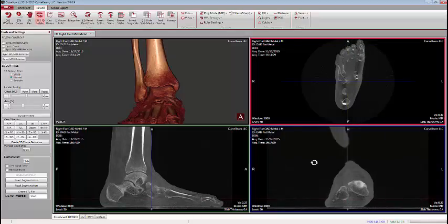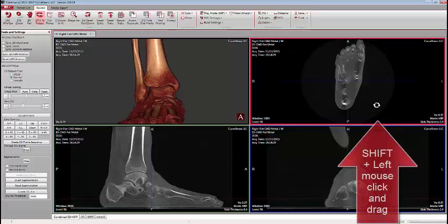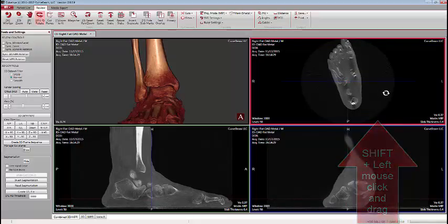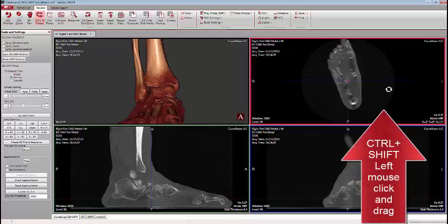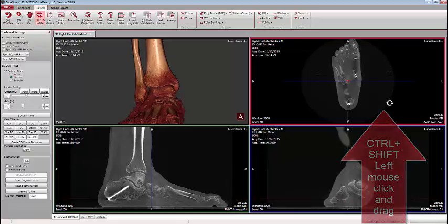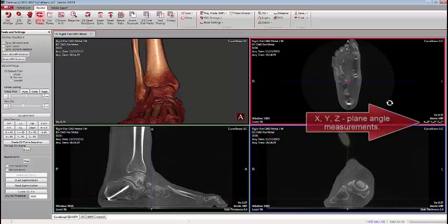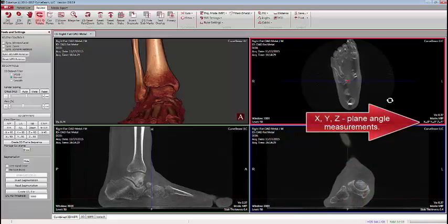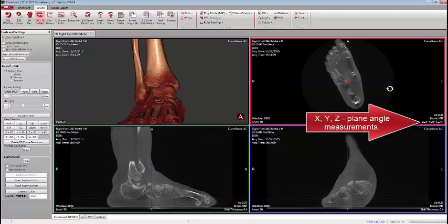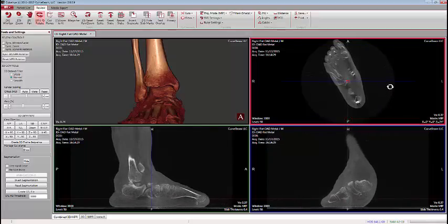When you let go, the other views line up. You can also get a more interactive experience by pressing the Shift key — the image rotates live, and when you let go, the other images catch up. Or you can press Ctrl and Shift, and all of the images will rotate interactively at the same time. In the lower right-hand corner, you will see that the angle measurement changes as you rotate — for example, Z equals 19, 20, 21 — letting you know how much you are rotating.